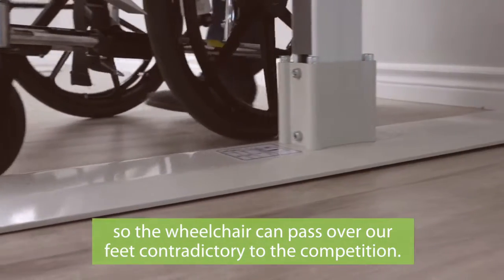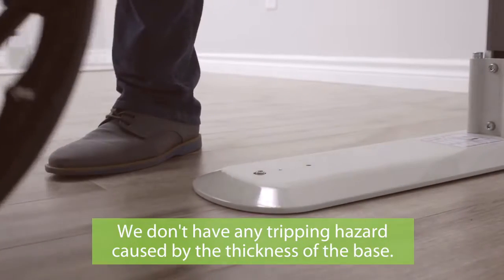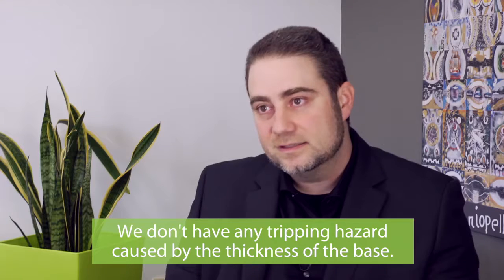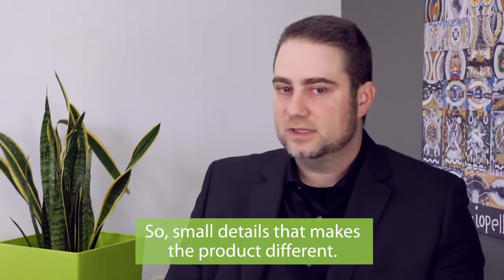So the wheelchair can pass over our feet, contrary to the competition. We don't have any tripping hazard caused by the thickness of the base — these are small details that make the product different.